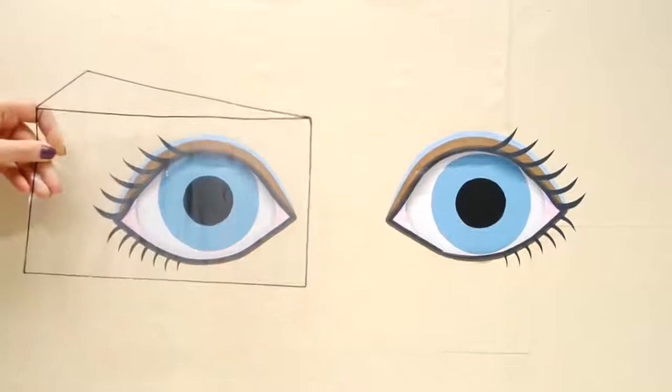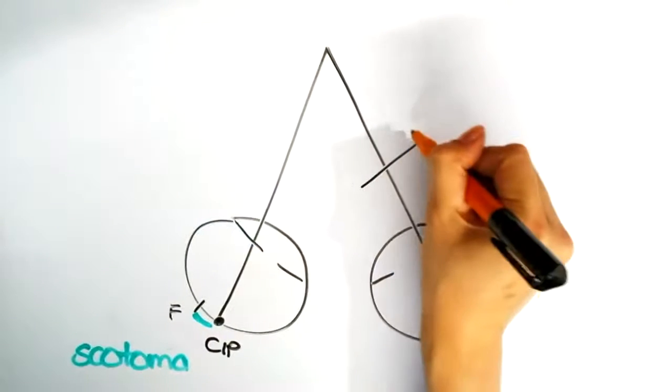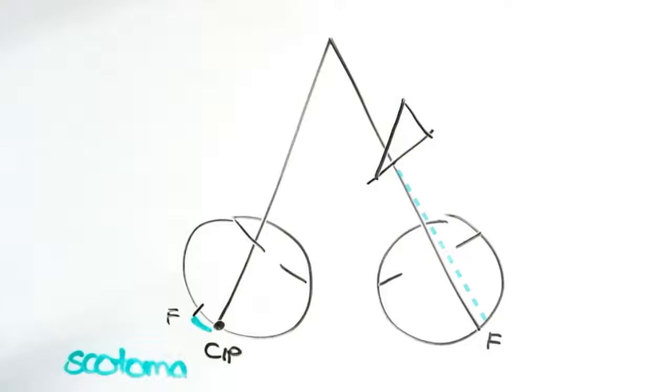When we put the prism on the non-deviating eye, you should see the eye under the prism move in and the conjugate movement of the other eye moving out. You won't see the conjugate eye moving back in to retake fixation as the image has now fallen on the scotoma.